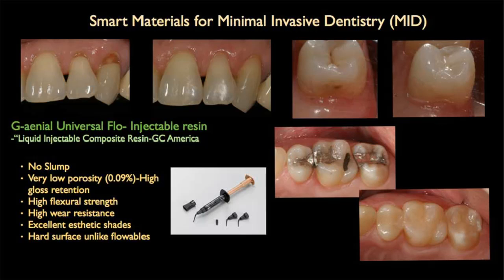What do we have in dentistry that allows us to restore this? Well, certainly, there's a lot of times we want to pull out that flowable resin to be able to restore it. But as we know, conventional flowable resins are just not restoratively sound materials. They're very weak materials because the ingredients have a lot of unfilled resin and resin matrix, so it doesn't allow it to be strong. But it would be nice in situations like this to be able to use a flowable type of composite to be able to create a result like this, wouldn't it?